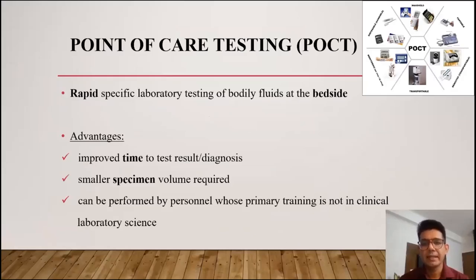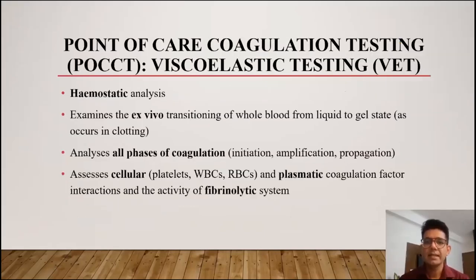Point of care tests are bedside tests which do not require trained lab personnel, and with the rapid test result, undue delay in patient management can be avoided. Viscoelastic test is an ex vivo hemostatic test which analyzes all phases of coagulation from initiation till propagation.